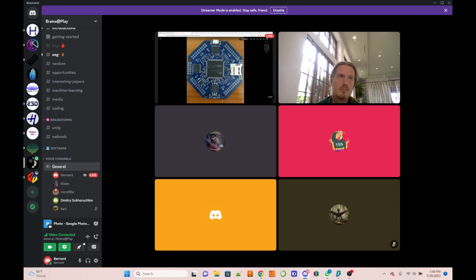It will become the main board which provides a clock. These jumpers or 0 ohm resistors, 4 of them, are modulating the clock and providing the clock. And if you remove them and solder, then it disables the clock on this board. Yeah. Because several clocks give you big interference and it's not EEG type noise. Not filterable. Yeah. So only one board can provide the clock, and these 0 ohm resistors or jumpers from 4 places enable the clock.